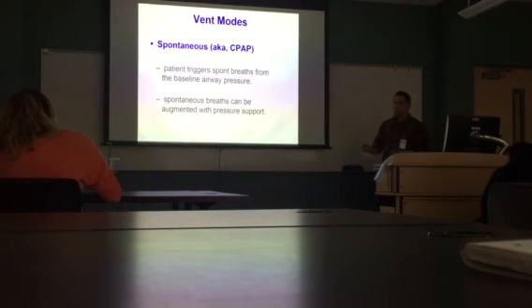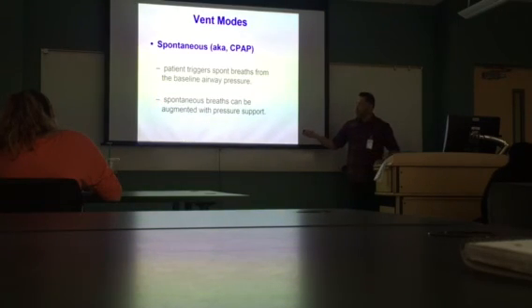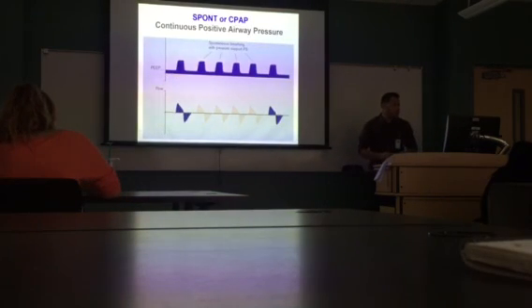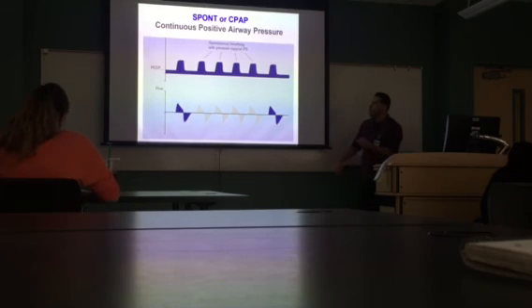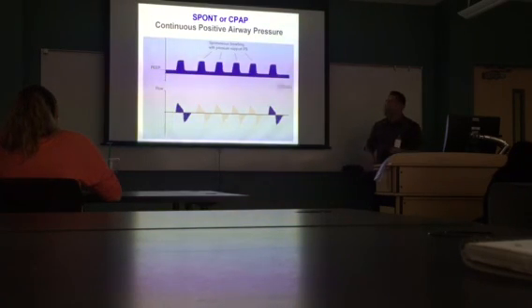So they determine how big of a breath they take or how shallow of a breath or even how fast. The only thing I do is I support their breathing, their spontaneous breaths, with pressure support. So notice this tidal volume that they're giving, or the breath that they're getting, it's whatever they determine. If the patient starts breathing more shallow, then the next one, you'll see that they're dropping as well.